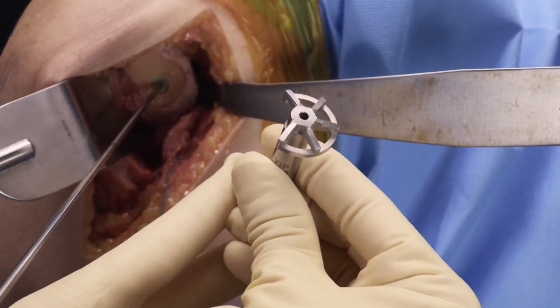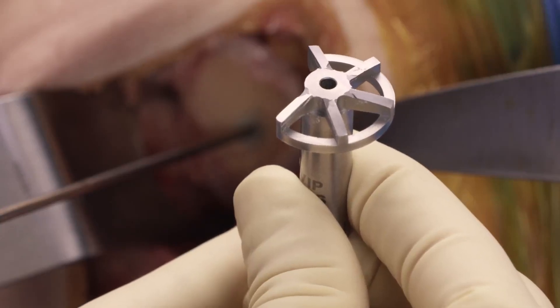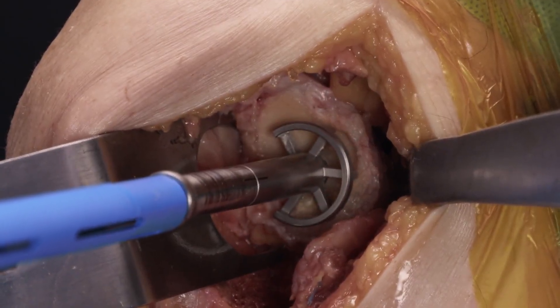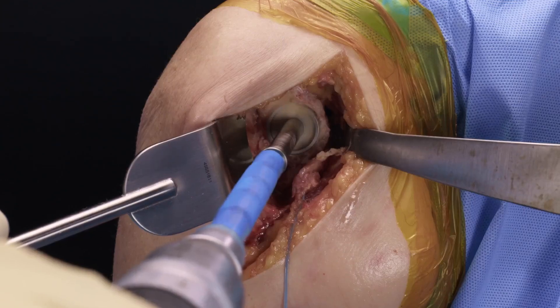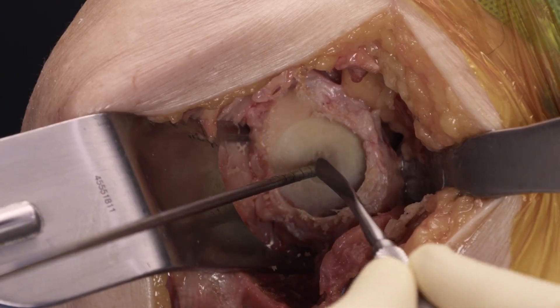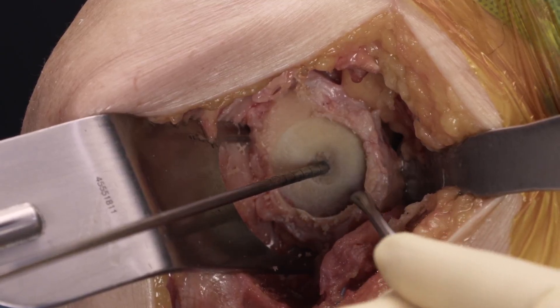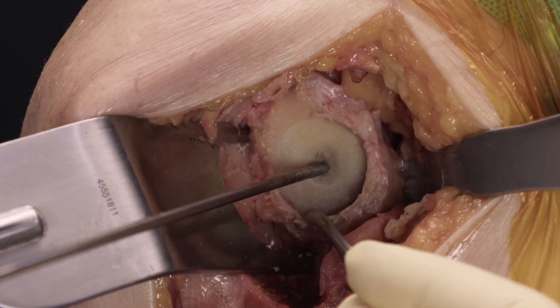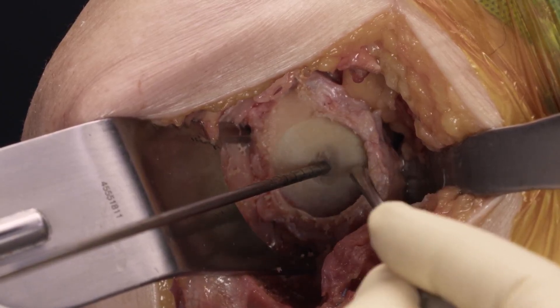Next we will use our secondary MGS VIP reamer. You'll note the key difference between this VIP secondary reamer and the standard MGS reamer is the flat smooth hub. We'll use our secondary VIP reamer, and this will ream until there's a positive stop. Now our reaming is complete. You can see that the pilot ream no longer shows, so we can be very confident that we've matched the depth of reaming from our VIP plan to get the backside seating we were planning for our MGS implant. We would then proceed with our standard MGS implant technique of reaming for the central screw or post and placing the base plate.